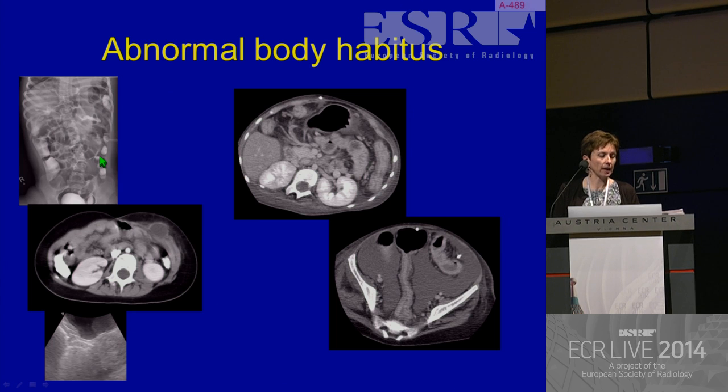And on a radiograph like that, whilst I'll try and put the probe on at the flanks, you're onto a hiding to nothing oftentimes. So the same question was raised as with the dislodged cecostomy tube. Is this an isolated abnormality, or does this infective process extend deep and involve the intraperitoneum? The answer to that question was no, and I happily drained that abscess under ultrasound guidance in theatres, but the surgeons wanted that reassurance that we couldn't give them due to all this gas on ultrasound.